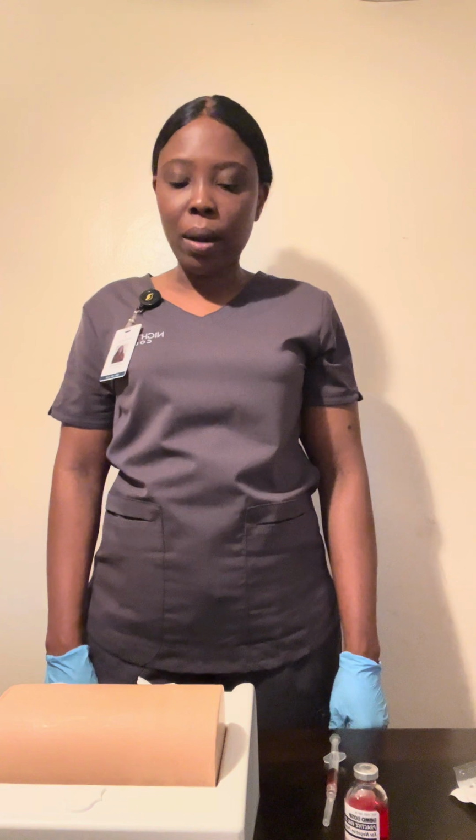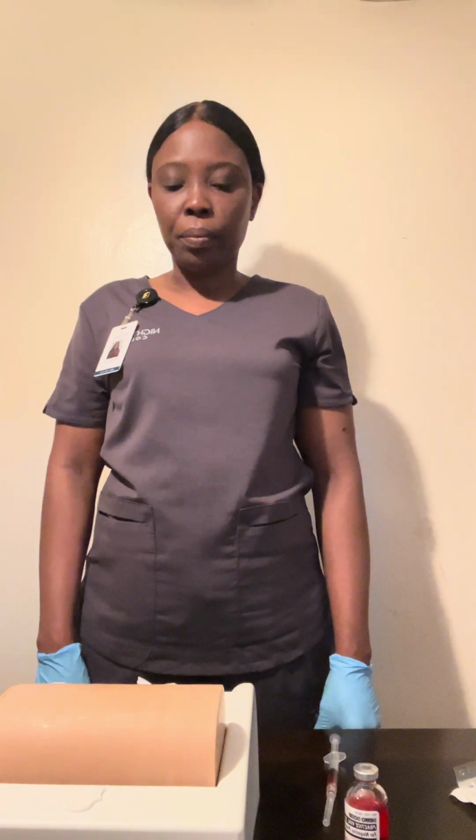And then now I'm gonna select the site, and make sure the patient is lying in the supine or lateral position. Today I'm gonna use the ventrogluteal site.